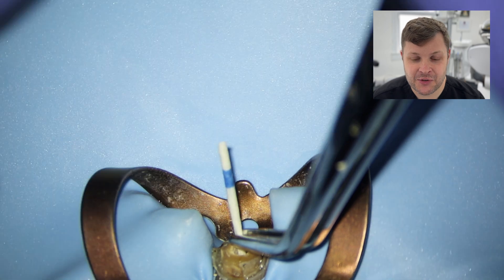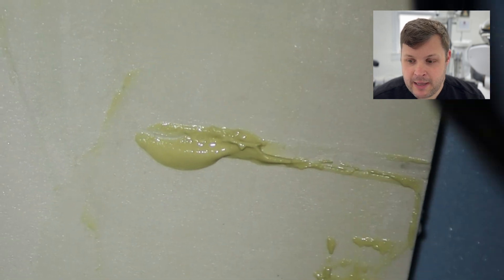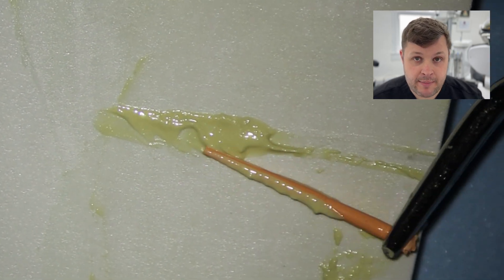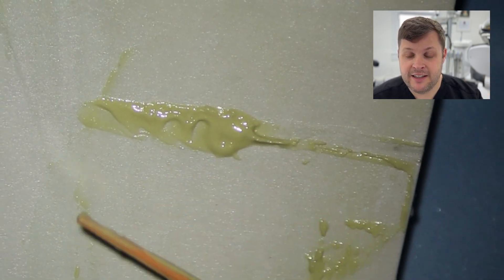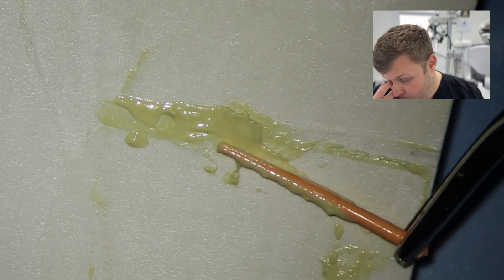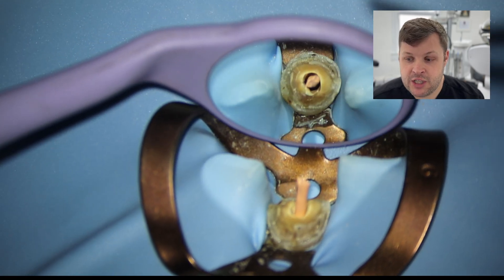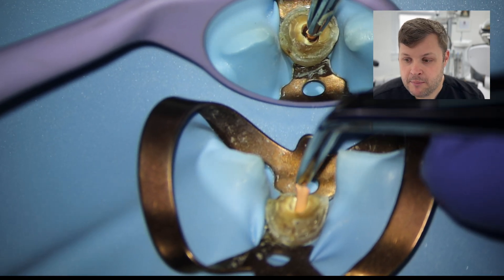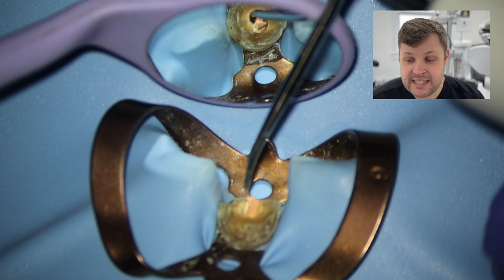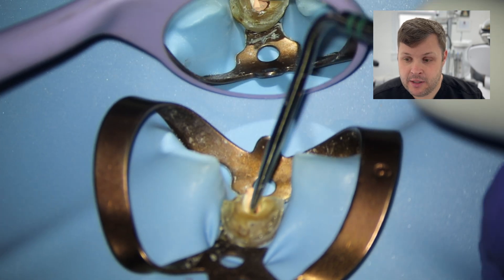I'd be interested to know what you think in the comments — do you prefer to dress teeth between visits? We're going to dry the canal with paper points and then use a resin-based sealer. You can't use bioceramic here because it doesn't work well with heat. I'm going to use AH Plus. The canal space is super wide — even with a wider diameter GP point, it's rattling around in there — so the single cone technique with sealer alone isn't going to suffice. We'll need to use a little bit of heat.